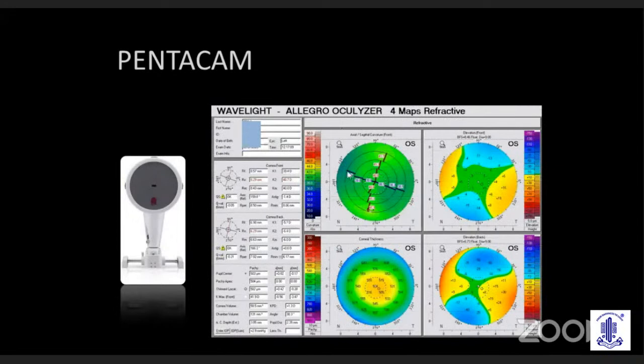Coming to the Pentacam, Pentacam is not a substitute for any of the keratometry values which you're going to do with the standard mode. This is actually something like a bigger picture where you can have assessment of the corneal health completely. When you have a peripheral thinning, when you have a keratoconus, when you have pterygium, scars, post-keratoplasty patients, you can actually see what's happening for the patient.